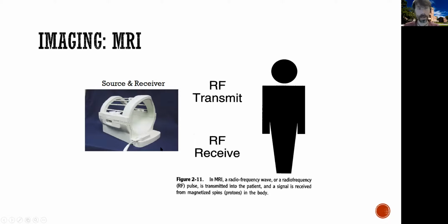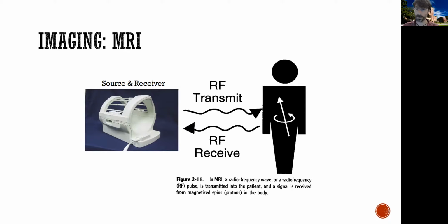So the idea in MRI, just like all other forms of imaging, is that the radiofrequency coil emits an energy. The energy enters the human body. We will see that it's really about hydrogen protons inside your body, inside water molecules. These hydrogen protons absorb the energy and then re-emit it, slightly changed.